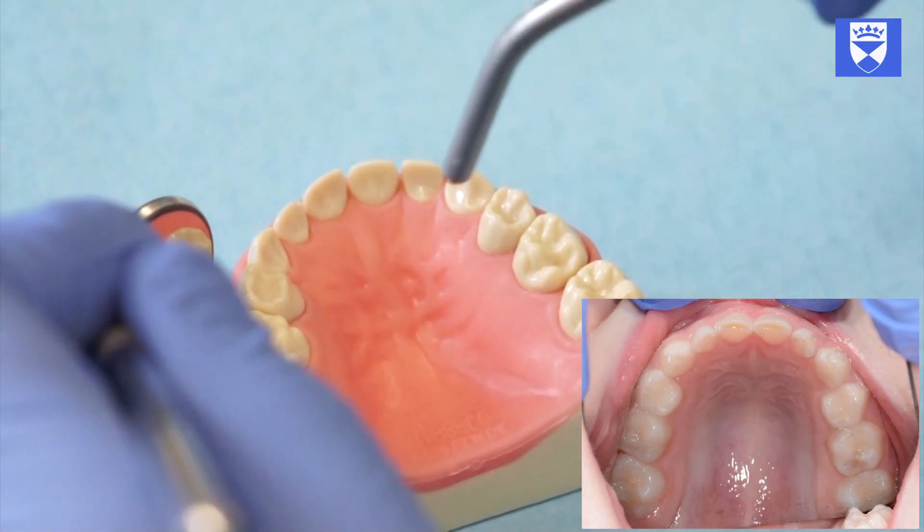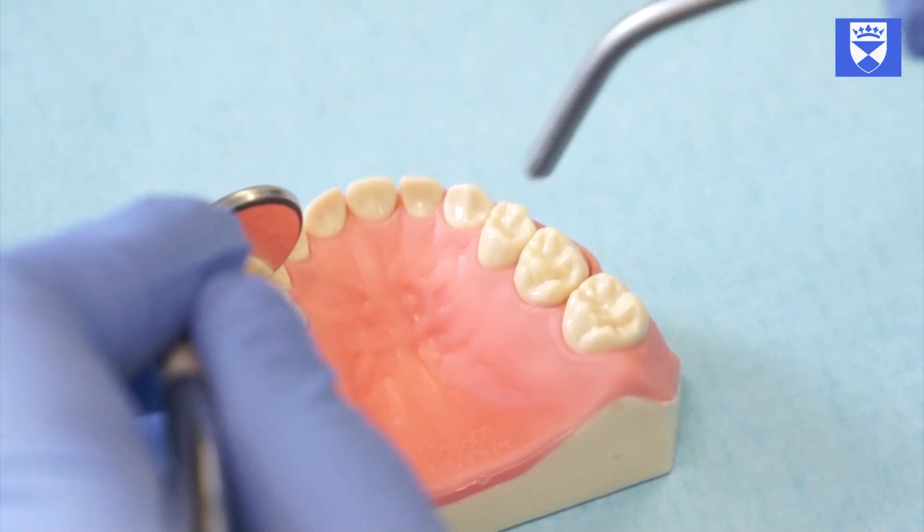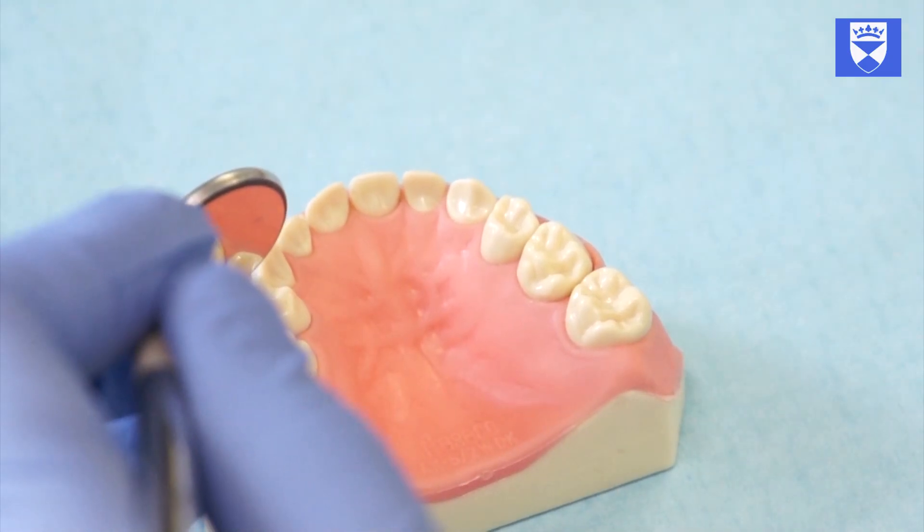Examine the tooth under direct vision if possible, or indirectly with a mirror depending on the location of the tooth. It is important that the tooth is examined when clean and dry and under good light.